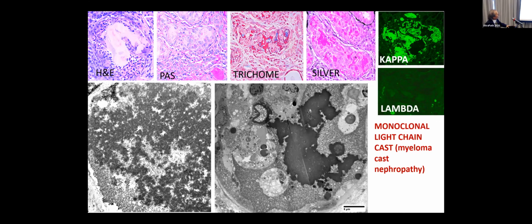And here is another appearance. In this particular case here, there is the geographic configuration, and there's also a cell associated with that, and the fracture area here. And I'm sure that Dr. Graham will tell you more about that. It suffices to say that some electron microscopic features of this cast can differentiate monoclonality from polyclonality, which are very important considerations.